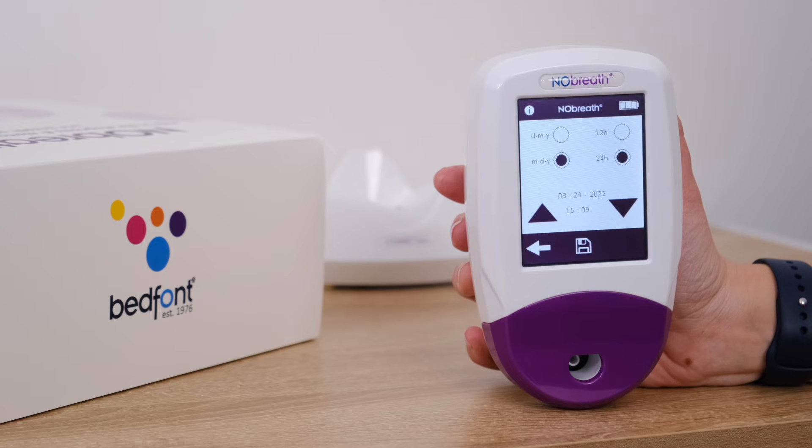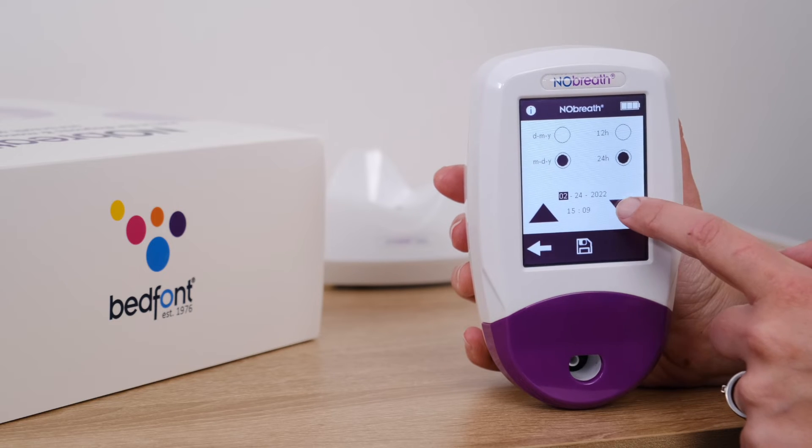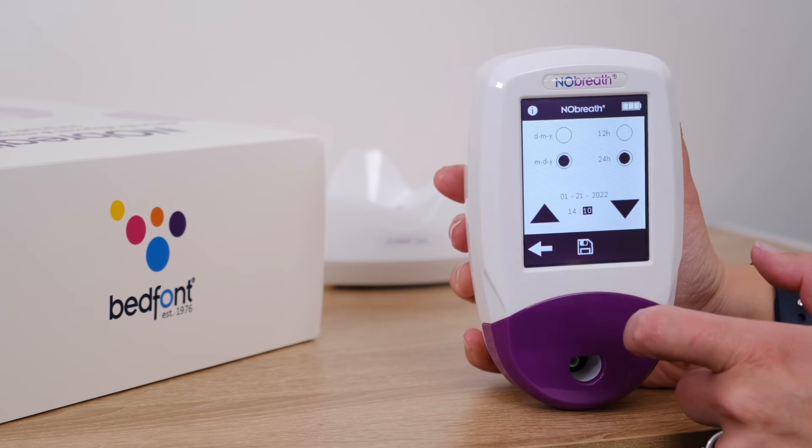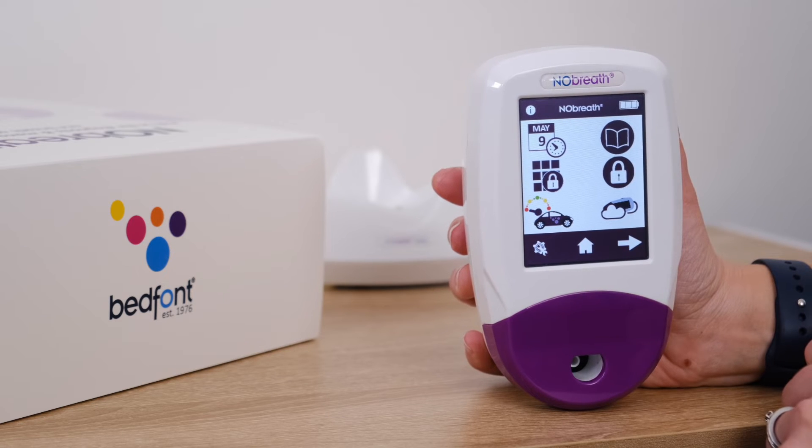To adjust the date or time, select the number and it will become highlighted. Use the arrows to change as desired. Press the save button to keep the changes. To cancel, press the back arrow to return to the settings menu.